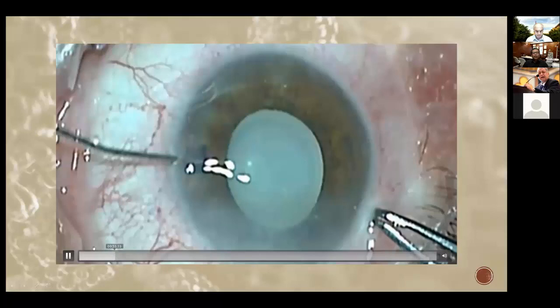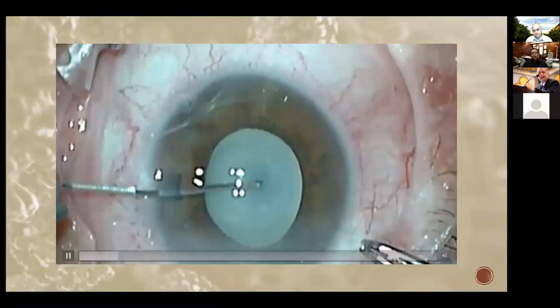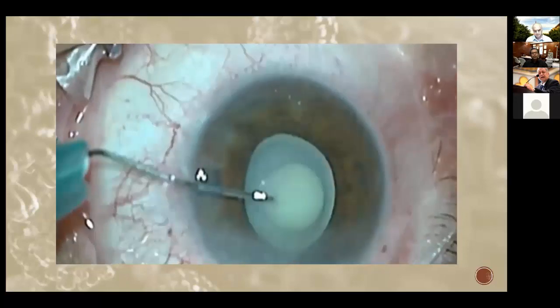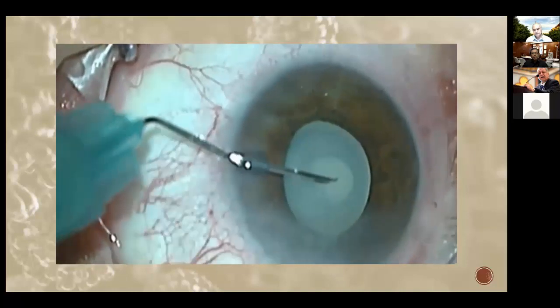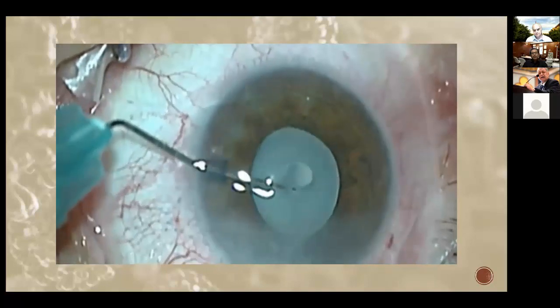Okay. So once I puncture the anterior capsule, as you can see, I get the milky fluid coming out. What I need to do is aspirate this milky fluid because it will hinder my visualization as soon as it starts spreading. And I start aspirating it.